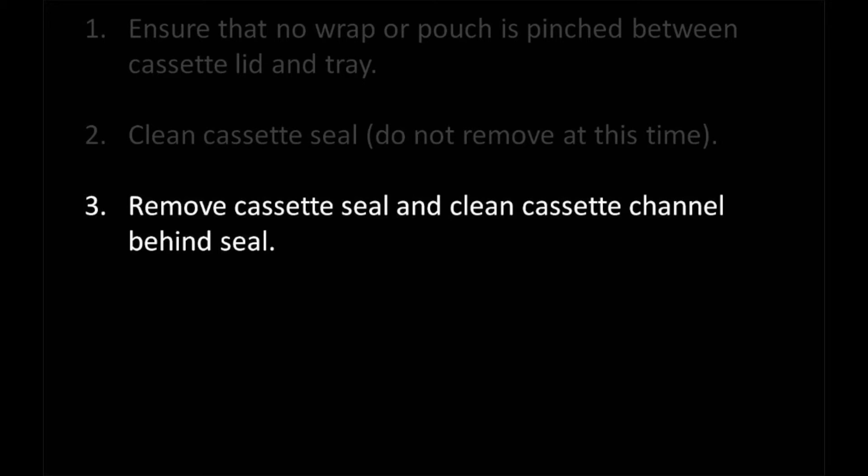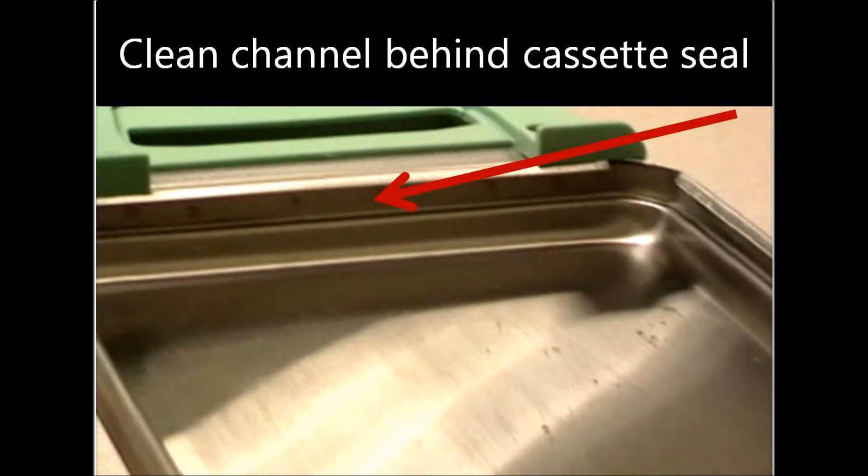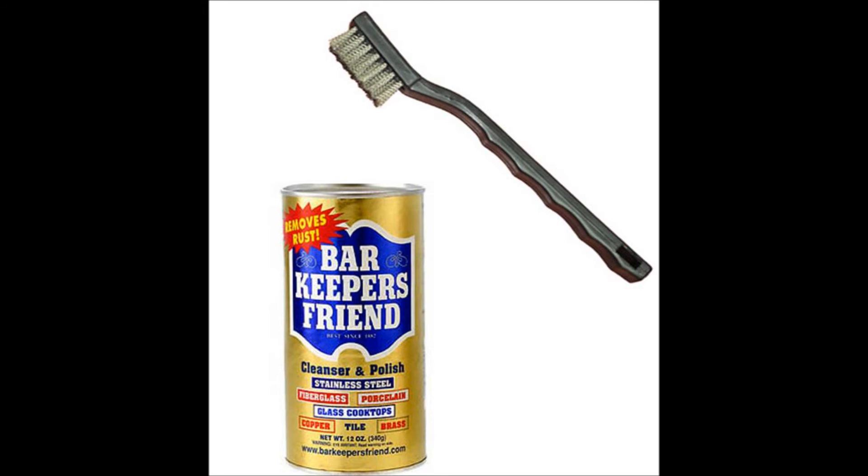Before replacing a new cassette seal, make sure you clean the cassette channel located behind the cassette seal. You may have corrosion or buildup behind the seal which is prohibiting the gasket from making a tight seal. You can use a small brush to clean this channel, and if debris is heavy, use a stainless steel cleaner like Bar Keeper's Friend to help remove the debris easier.